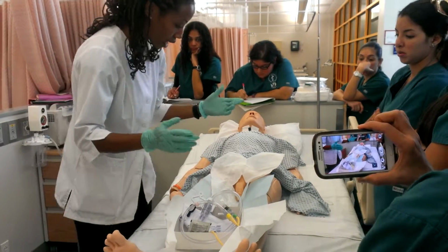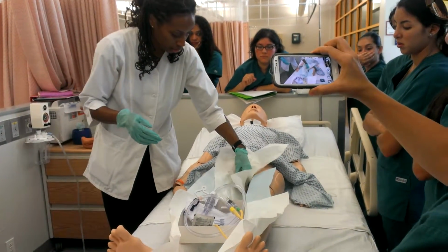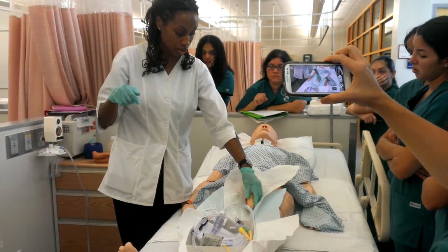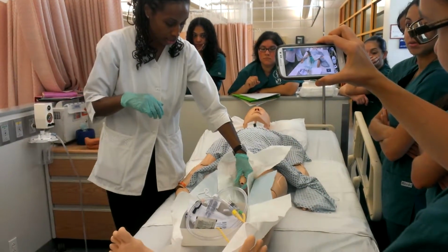So with the men, same thing. Whatever hand you put down first, it stays down. So you grab the penis, and you're making sure that you know where you're going. If they're uncircumcised, you have to retract the skin. So that's where you're pulling the skin back. So you retract the skin.